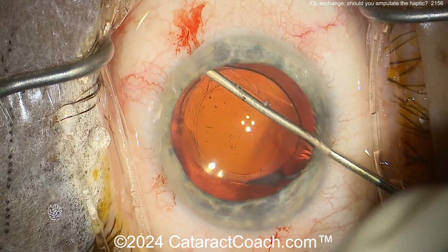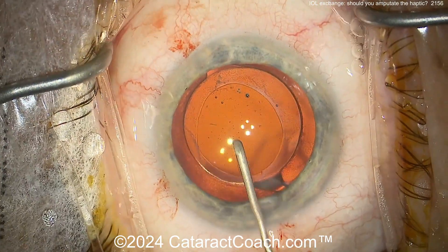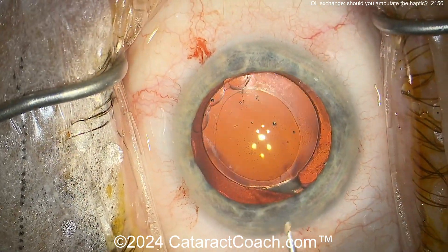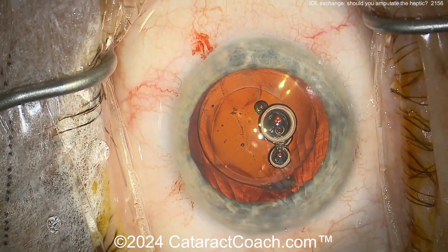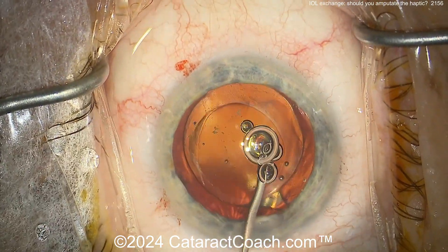Here's going under the rhexis edge with a blunt instrument to separate and create a space, and then you can do a visco dissection. There's the viscoelastic — you want to separate the anterior and posterior leaflets of the capsule.